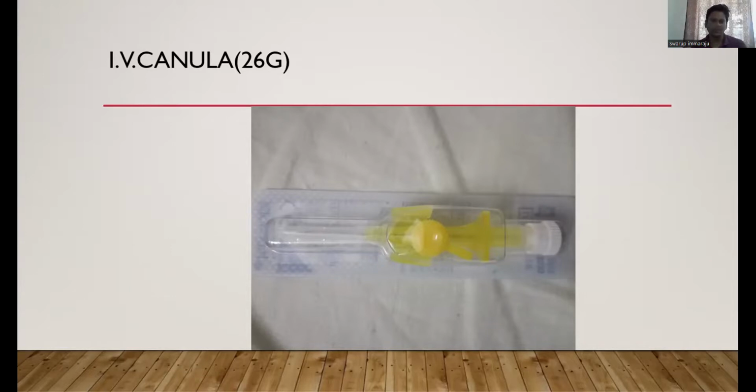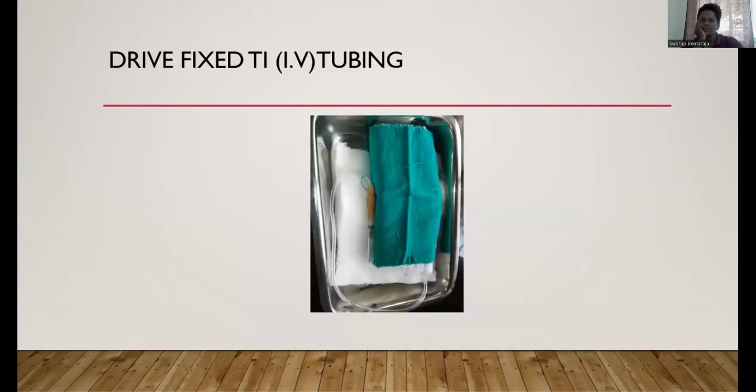So it is comparatively more comfortable, because the needle comes back and is disconnected, and only the plastic or rubber tubing remains underneath the skin. It is more helpful compared to the butterfly needle. It is more comfortable. The only thing is the family has to be explained about what it is. Next slide, please. We'll talk more about that.